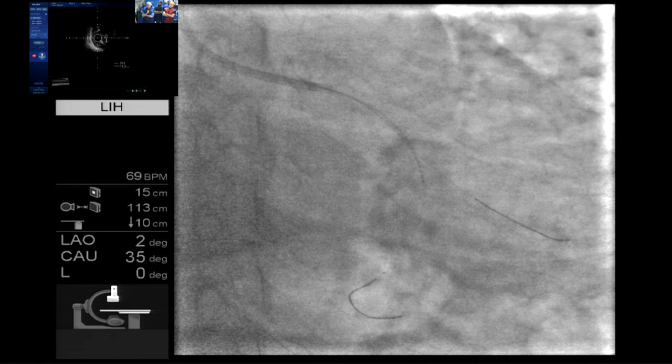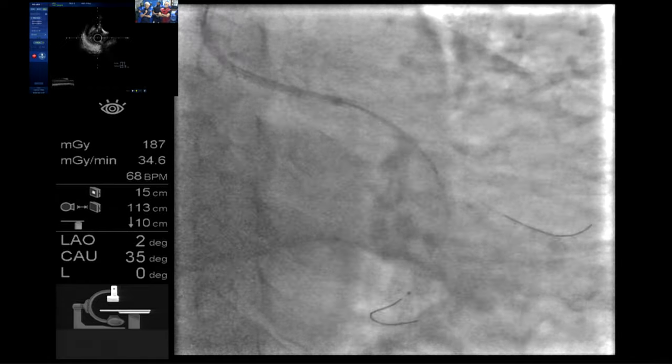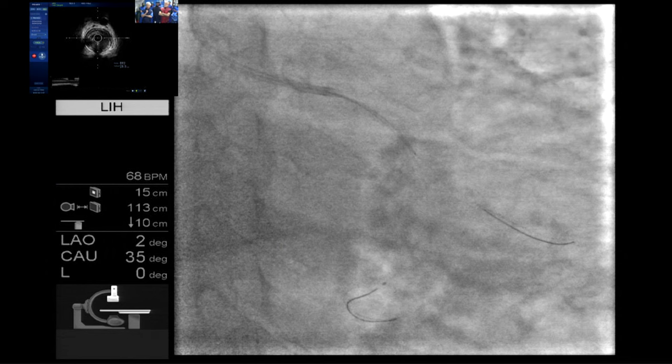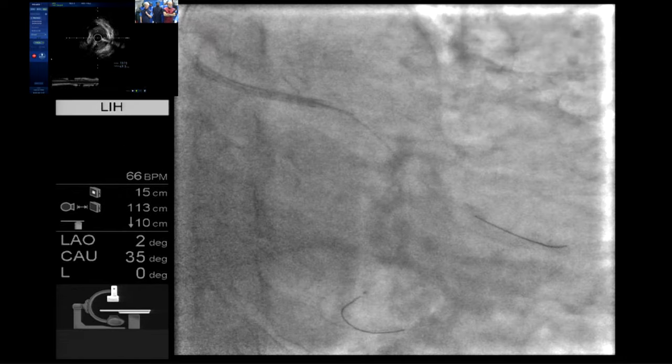And here we can identify the plaque and the bifurcation, right? This is a bifurcation. It's the OM coming in, and this is a proximal site. It's much bigger. Nearly 4, right? About 4 or 3.5 here? Around 4, I think. This is the wonderful place for the landing zone, right? So I can land it right here, or slightly before. So we're landing zone. Good. Let's stop the IVUS.